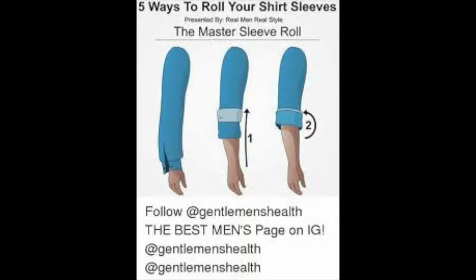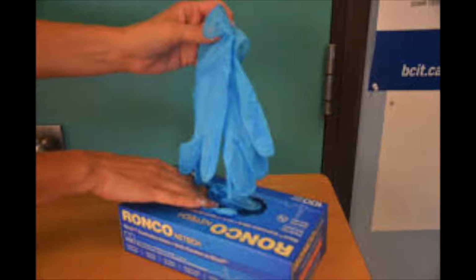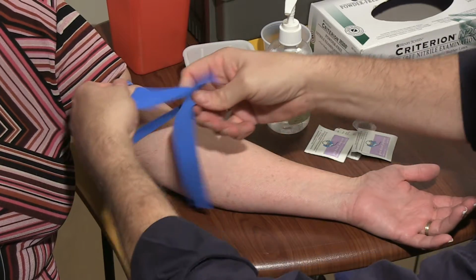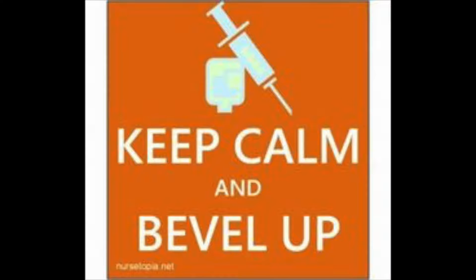Right? Then if you're ready to proceed, I'll ask you to roll up your sleeve on the left while I wash my hands and get some gloves. This procedure will be similar to your previous experiences. I'll place a tourniquet on your arm. I'll clean your skin with some alcohol. I'll take a blood sample for 2 tubes. Once the sample is collected, I'll remove the needle, apply some pressure, and cover the site with a bandage. Are you ready to proceed?